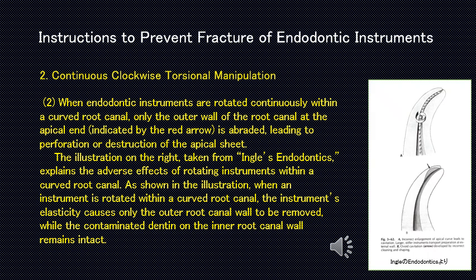As shown in the illustration, when an instrument is rotated within a curved root canal, the instrument's elasticity causes only the outer root canal wall to be removed, while the contaminated dentin on the inner root canal wall remains intact.